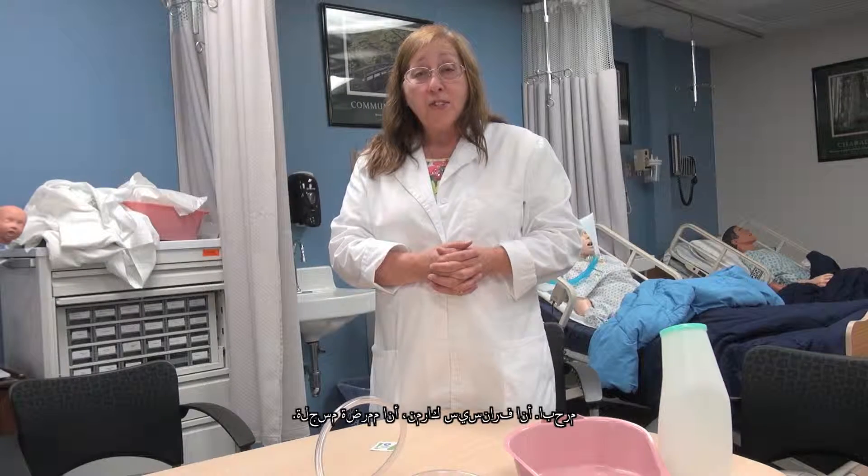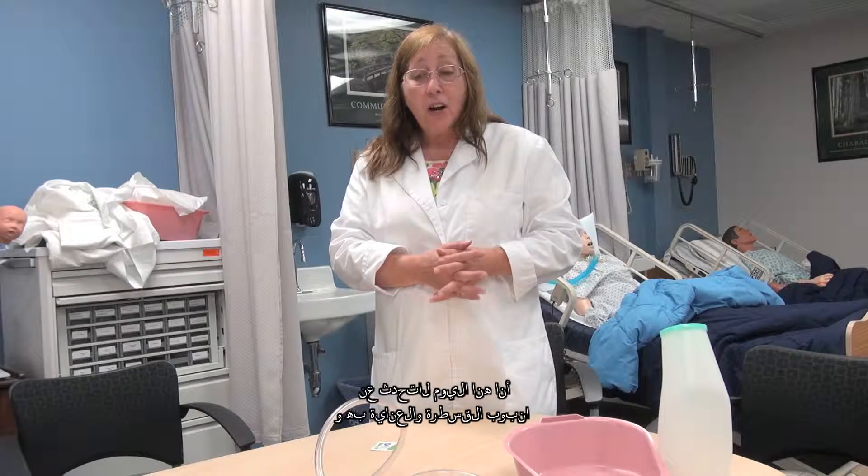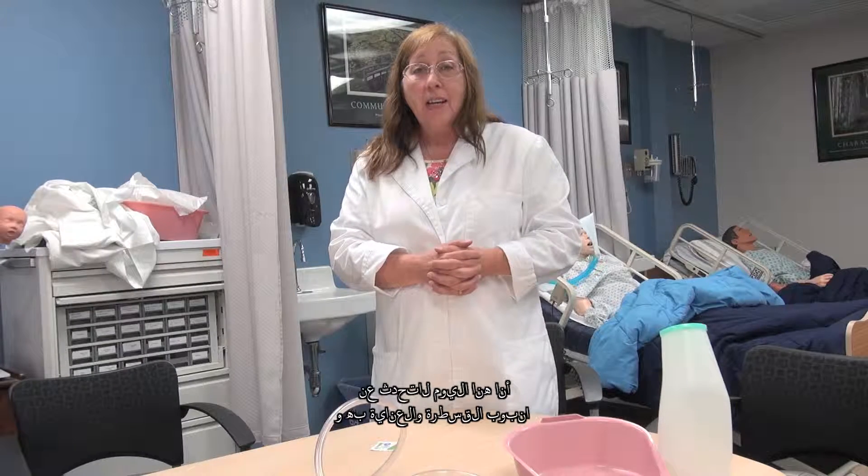Hi, I'm Frances Carman. I'm a registered nurse. I'm here today to talk about catheters, catheter care, and catheter drainage bags.